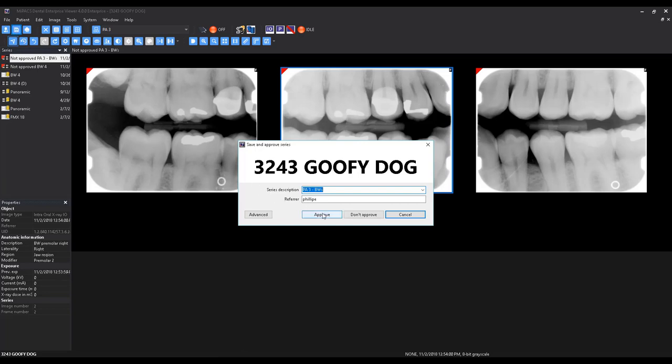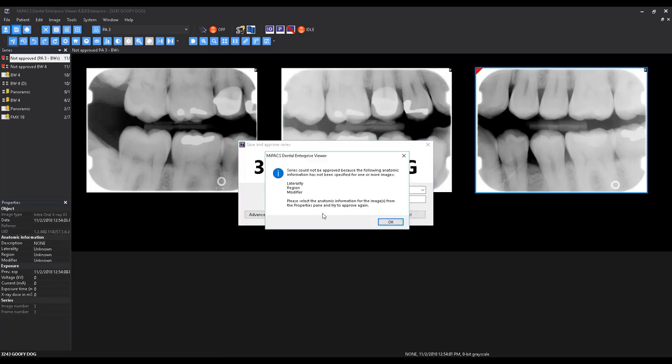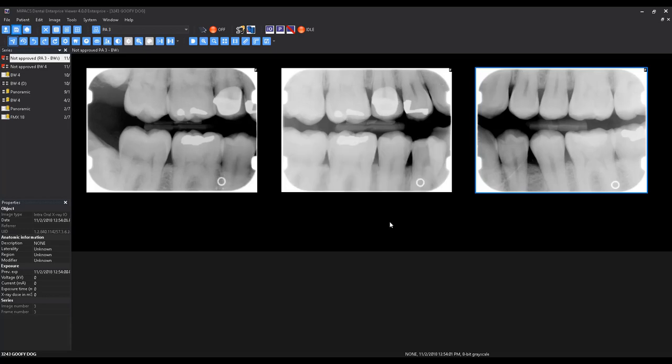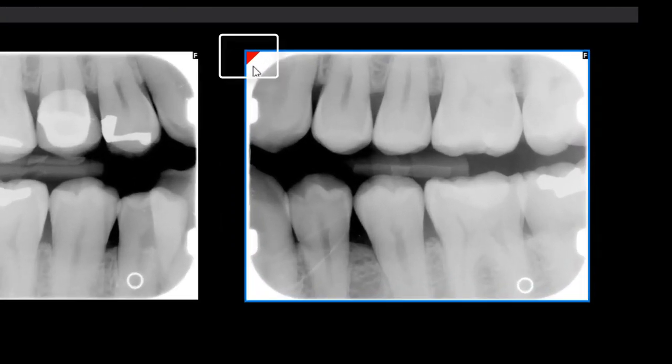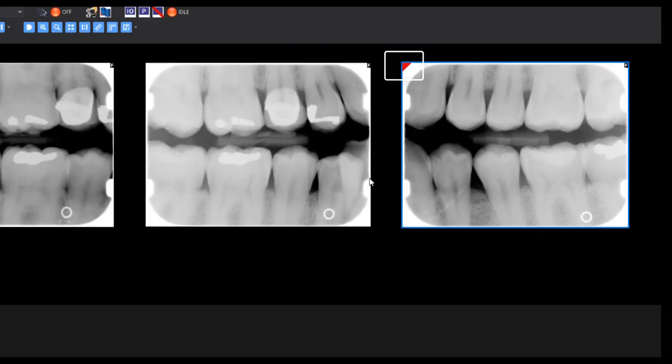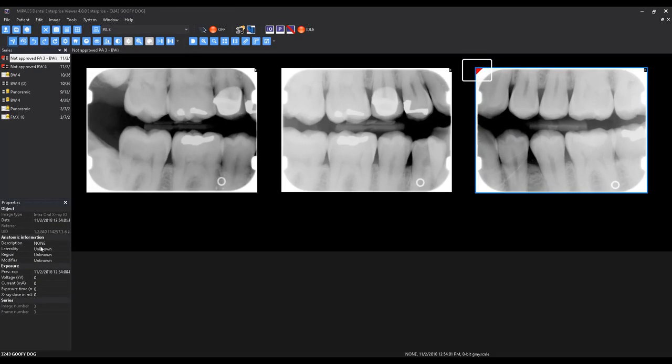If, after attempting to save the series, you happen to forget to specify the anatomic information for one or more images, you can easily identify which images still need additional information by the red dog ear in the upper left-hand corner of the image.